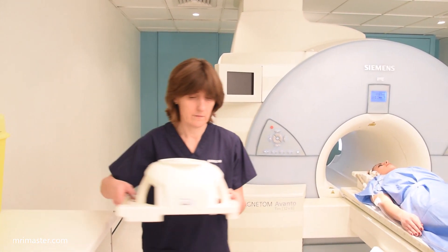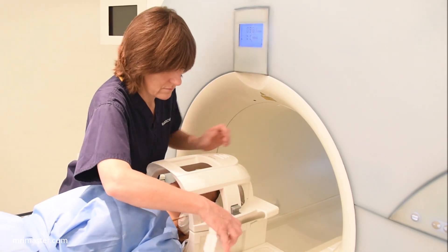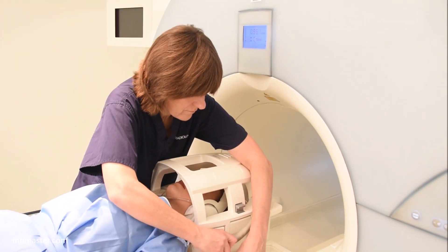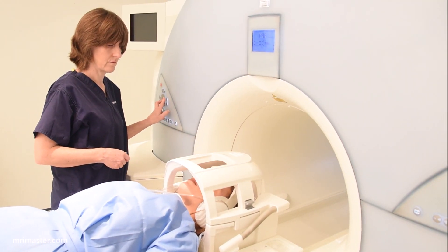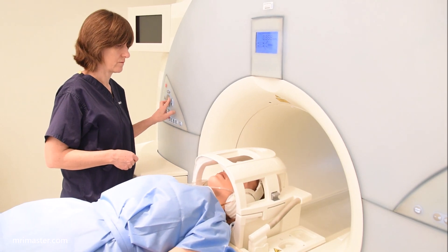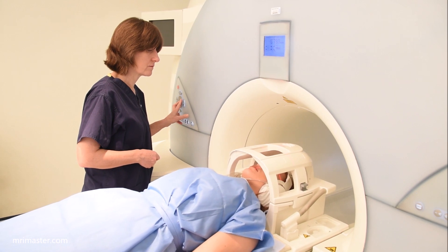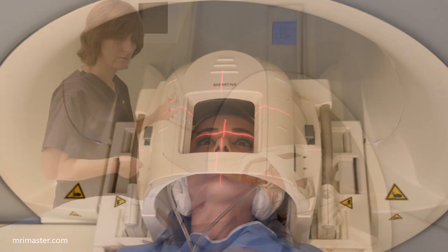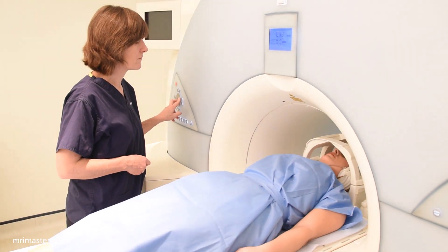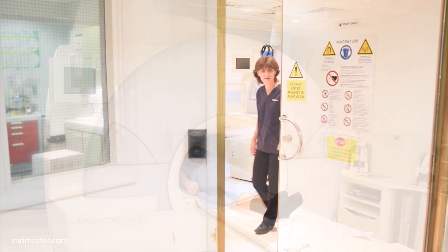Give the patient ear protection in accordance with the manufacturer's guidelines. Attach the head coil. Move the patient carefully into the scanner and centre to the glabella. Now move the patient fully into the scanner. Make sure the patient is calm and comfortable before leaving the room.